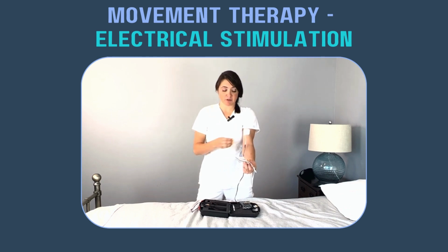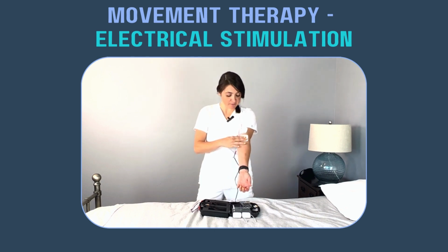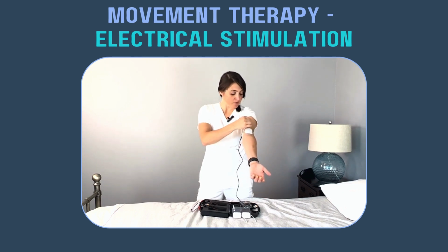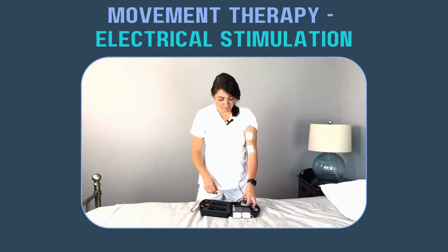So what you're going to do is take an electrode and place it on a meaty part of the arm. You never want to go on a bone, it just should feel super meaty. And then you're going to take the other prong and find another spot. Don't be afraid to do this because you can always readjust. So let's say I did this and I wasn't getting good movement. I could say, maybe I need to go in a little more and up a little higher. Okay, don't be afraid to do that. But always turn the machine off before you do that.